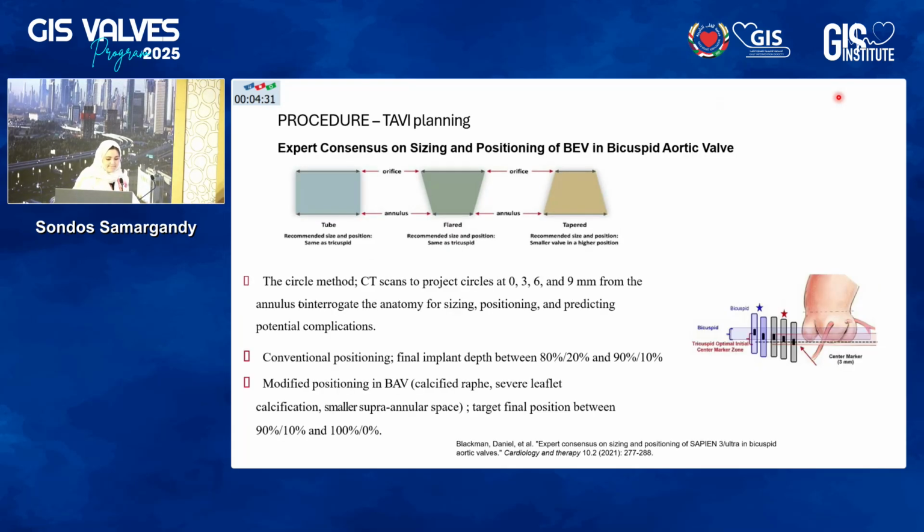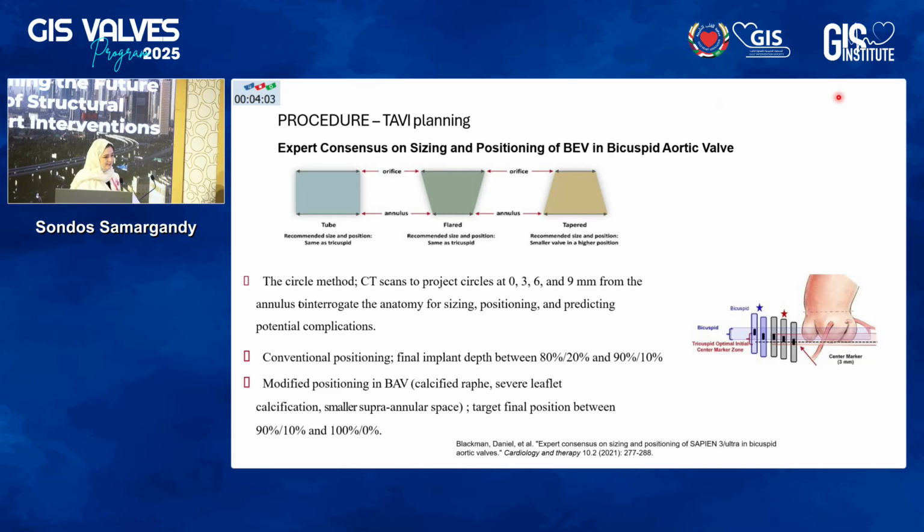So thank you, Dr. Sondos. I think the standard views to assess the aortic valve procedure, in addition to the prosthesis location, are very important. We also have to add the Doppler assessment, so every view that helps us in getting the proper Doppler alignment to give you the maximum gradient that we can check. And then we have to focus on views that can assess paravalvular leak. So the short axis as well as the long axis views and the apical views will also help you for the paravalvular leak. So the migration of the prosthesis, the gradient, and the presence or absence of any leak.